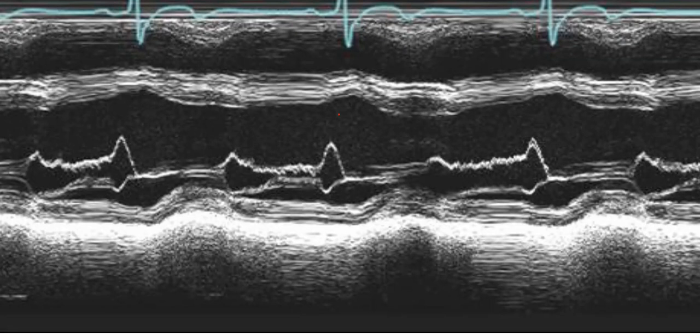What indicates the severity of AR is when the AR jet is large enough to impede the opening of the mitral valve. So the premature closure or the limited opening of the mitral valve is the sign of severity. It's not the flutter. It's the limited excursion of the mitral valve.